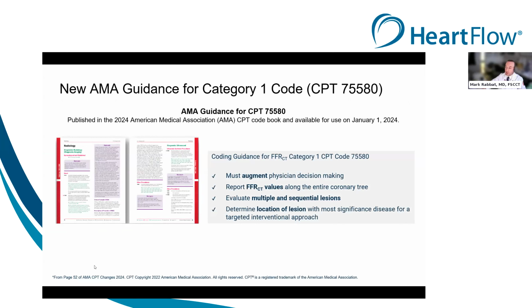You must augment physician decision-making. We should be reporting FFR-CT values along the entire coronary tree, evaluate multiple and sequential lesions, and determine the location of the lesion with the most significant disease for a targeted interventional approach.